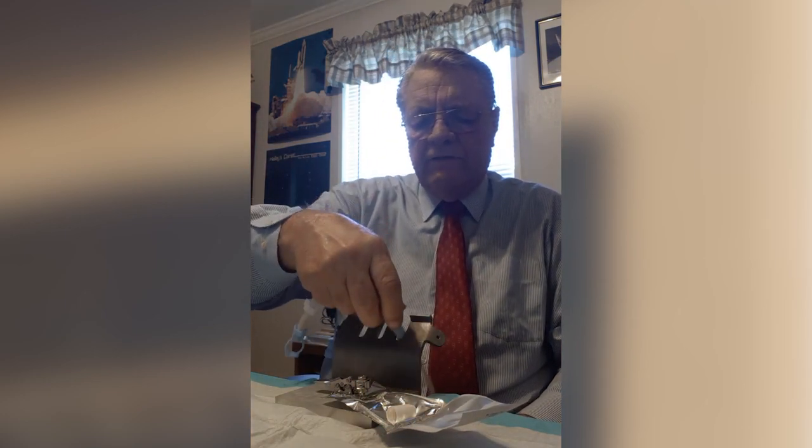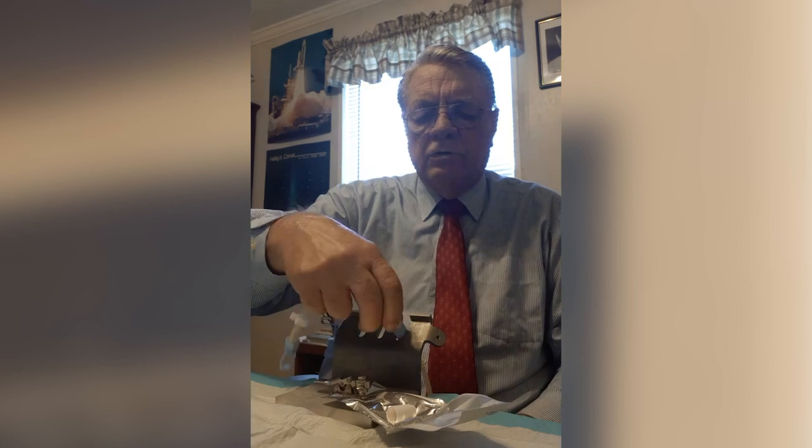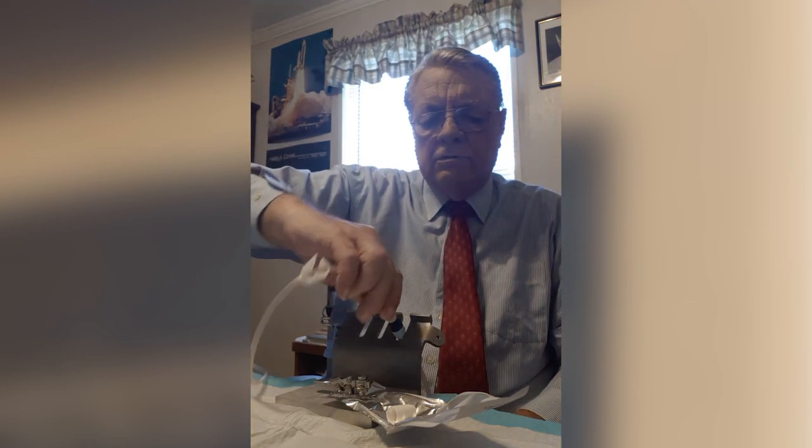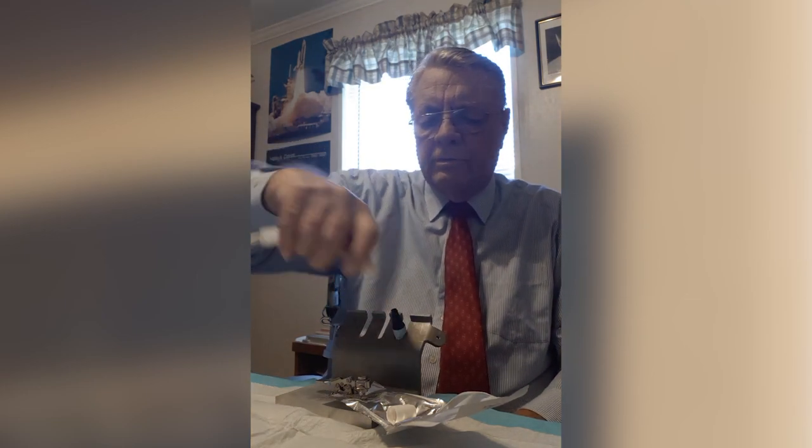We take our valve, put that in here, but now we're going to close the valve, turn this over, place the valve like that. Now we can simply unscrew the tubing and place it right here for safekeeping.